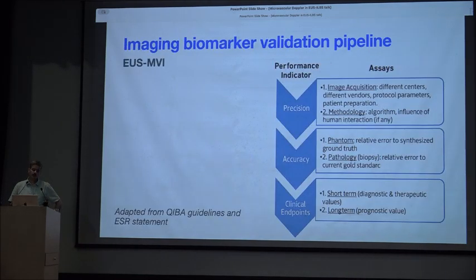My last slide. Finally, DFI is a new modality, and it has to be considered what is called an imaging biomarker. And the QIBA guidelines, Quantitative Imaging Biomarkers Alliance, and ESR, European Society of Radiology statements tell you how an imaging biomarker should be evaluated. So image acquisition, I was talking of protocols, methodology. We have to work on phantoms. We have to go back and look at pathology, short-term clinical endpoints, long-term clinical endpoints before we can use DFI more widely.